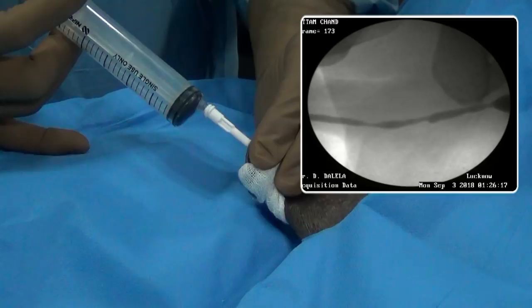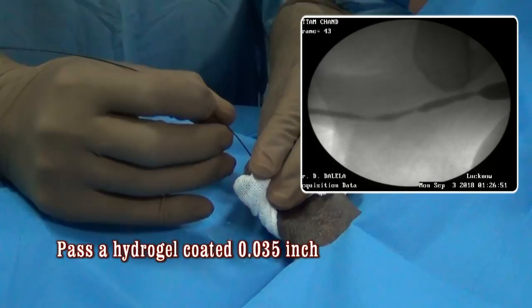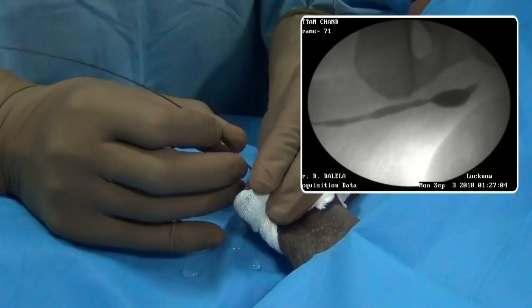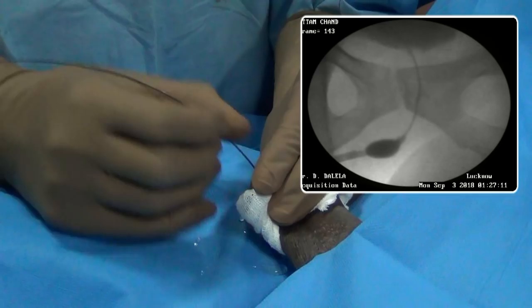Then pass a floppy-tip hydrogel-coated guide wire — it is a 0.035 inch wire. Gently insert it into the urethral lumen. Because the urethra is well lubricated, it will find its way through the stricture and go into the urinary bladder. By the loss of resistance and the ease of passing the wire you will know you are in the correct passage. Introduce a little more wire into the bladder so that it does not slip out.